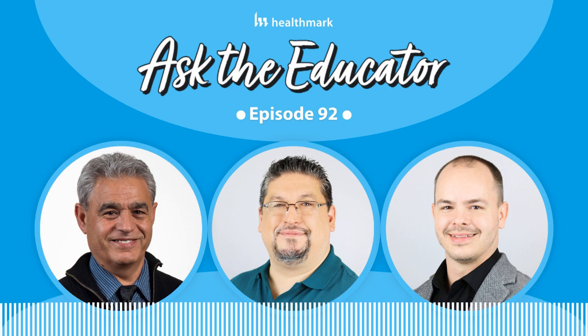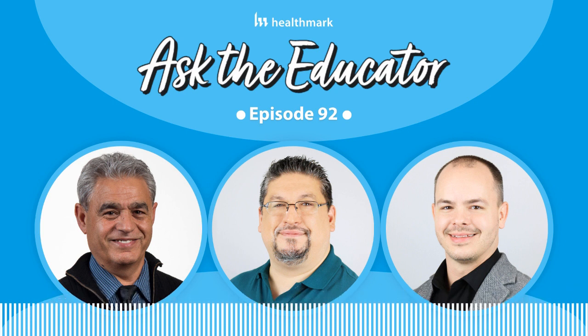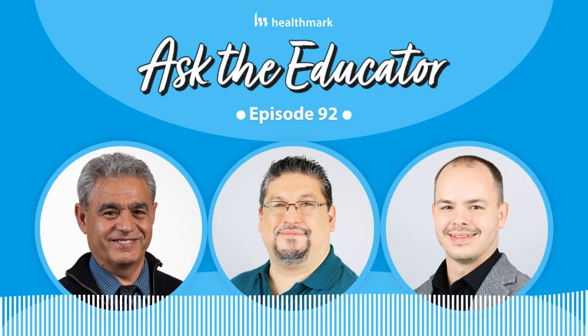reusable cords. Disposable, obviously, hopefully the manufacturer did that quality control, and when you receive it, it's been tested. But yes, you must test them per manufacturer recommendation, and you're correct. So we have the standards, we have the issues with FDA, but at the end of the day, when something happens, the manufacturer's IFU trumps everything else. So that's the important part that people need to take into consideration when you're looking at any devices.